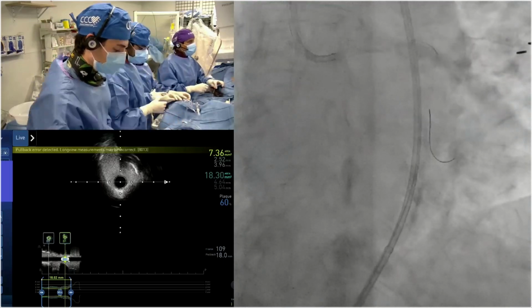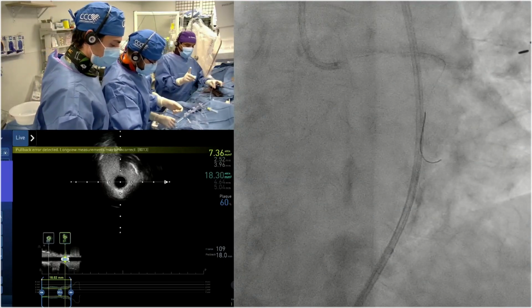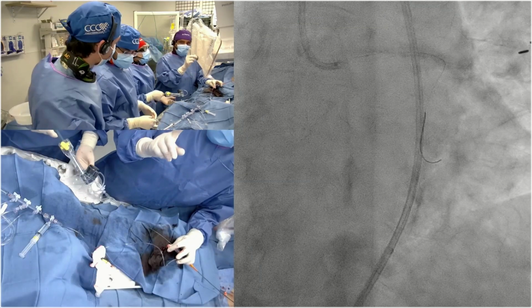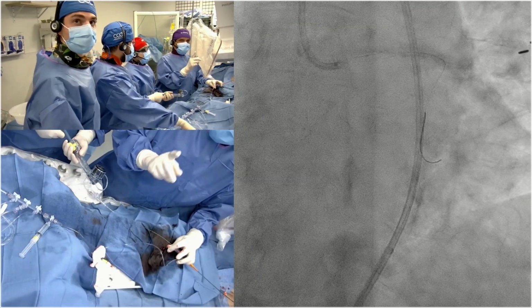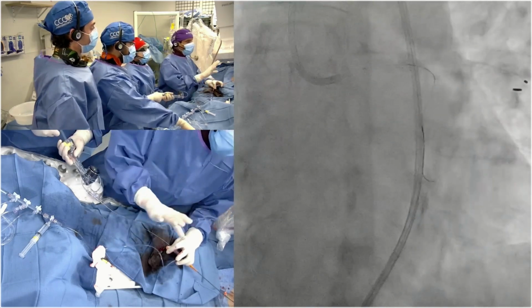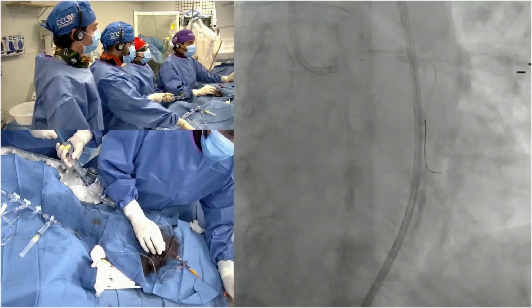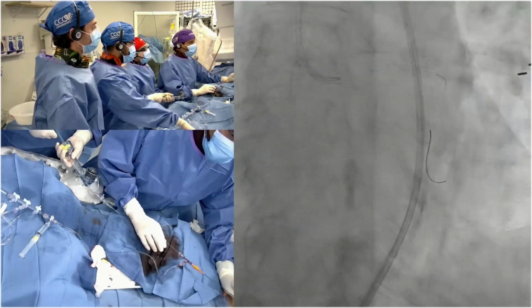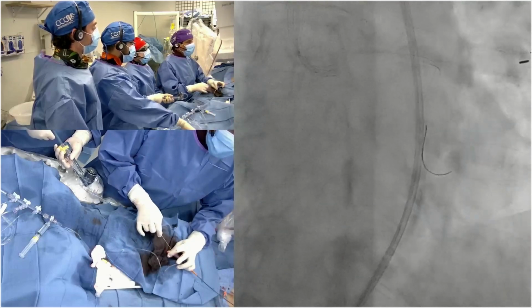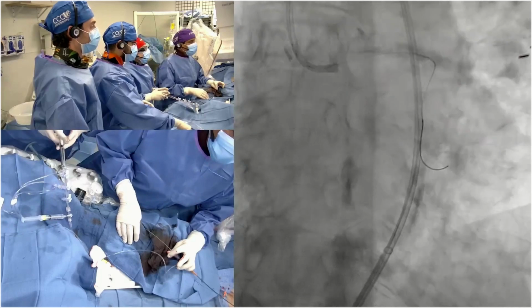Now, if you people recall, in the OCTOBER trial, like 25% were left main. There was stent distortion by the guide catheter in 10 to 12% of cases. So very careful. We always say, once you have put a stent in the left main, make sure you advance your guide on the balloon. Your guide alone will invert your ostial stent, and that was seen clearly in the OCTOBER trial, that stent deformation in the left main cases.